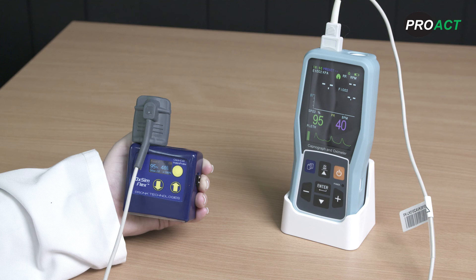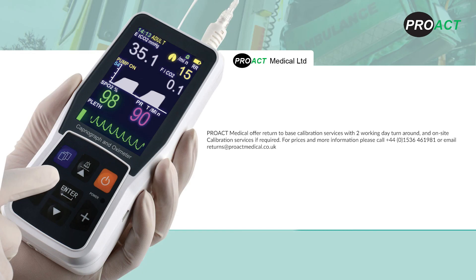Finally, check that the PC-900B is not damaged, is charging properly, and if required is cleaned with 70% isopropyl wipes and/or a slightly moist (not wet or dripping) soft cloth with mild detergent. Do not allow water ingress as this will invalidate the warranty. You should perform calibration checks annually at a minimum. Proact Medical offer return-to-base calibration services with two working day turnaround and onsite calibration services if required. For prices and more information, please call 01536 461 981 or email returns at proactmedical.co.uk.